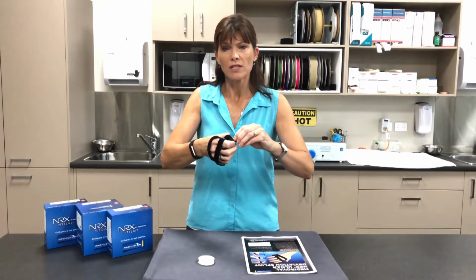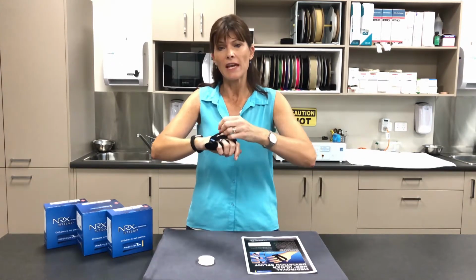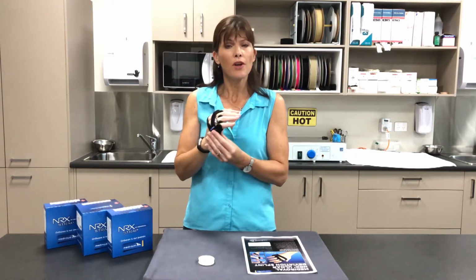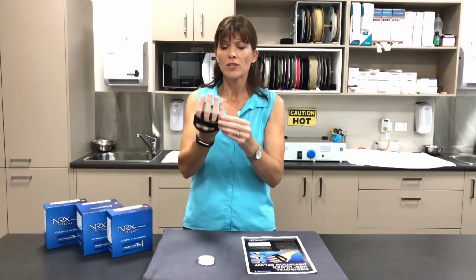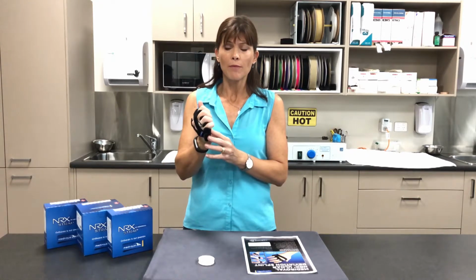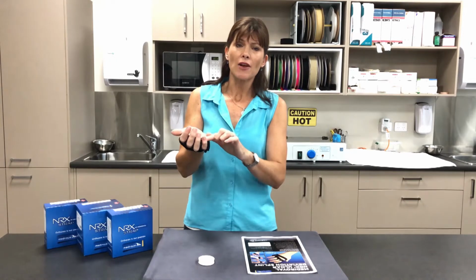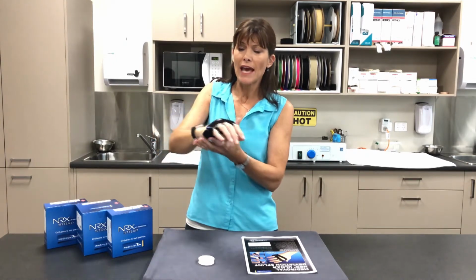It can also be used as a resting hand splint or overnight to reduce the pain and deforming forces during sleep. And in neuro clients, the splint can also be used to separate fingers. So for example, in stroke patients who have problems with palm hygiene, or it can be used to protect that palm area from pressure.